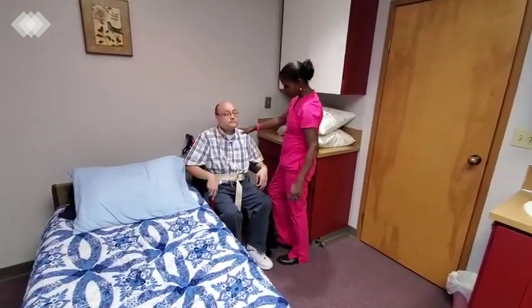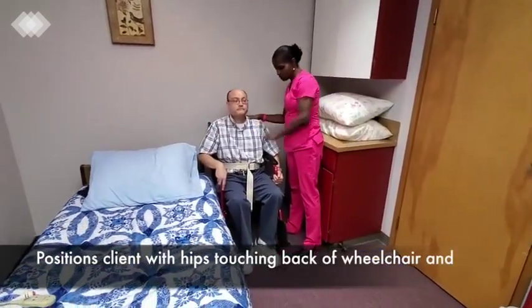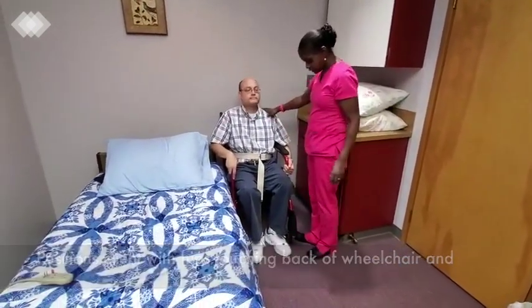There we go. Now that you're sitting down, I want to make sure that your back is touching the back of the wheelchair. And it is.